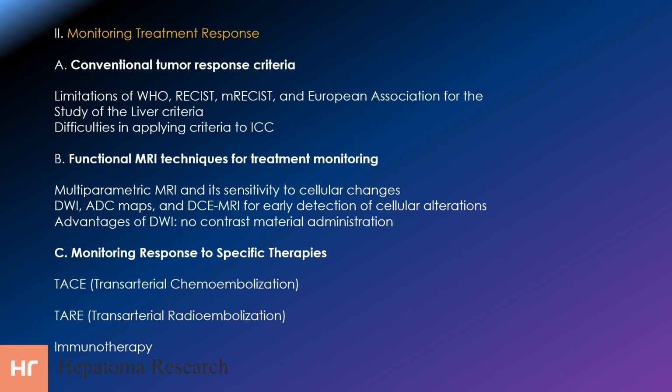In the context of immunotherapy, MRI quantitative features have been explored for predicting immunophenotyping and outcome in ICC patients. Pre-treatment MRI features such as ADC value have been associated with early progression of unresectable ICC with systemic therapy.